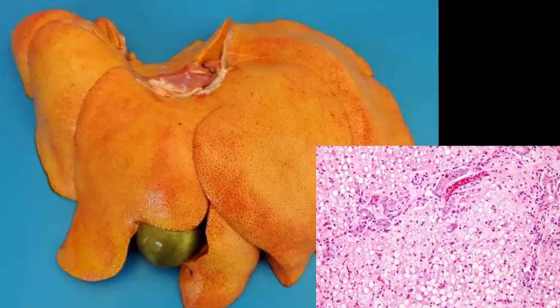Okay, think about that one. Well, time's up. We had to pick one. The correct answer is B, aflatoxicosis. Okay, now we got a couple of things going on with this liver. Let's take a look. Number 1, the liver is orange-yellow, and that correlates with all of the fat that is seen histologically. If I look histologically, I'm also seeing some chronic changes here. Do you see the multiple profiles of bile ducts?